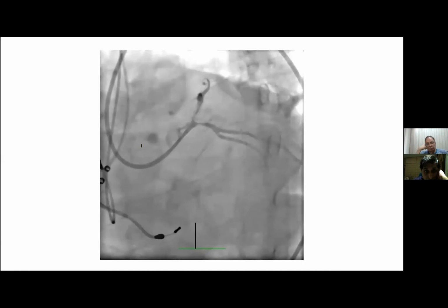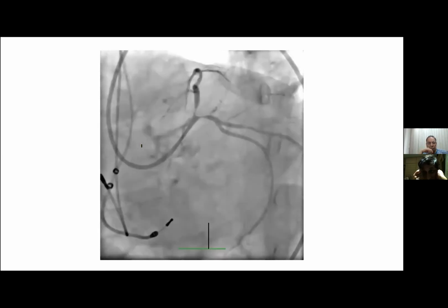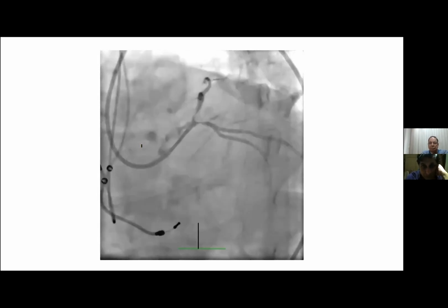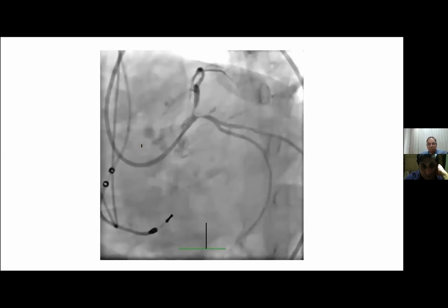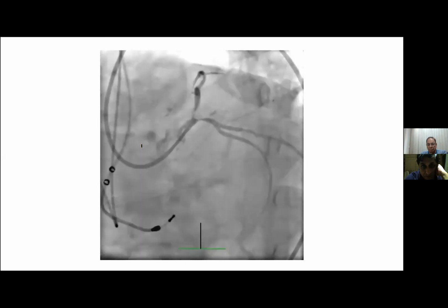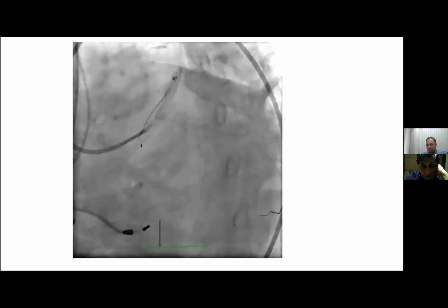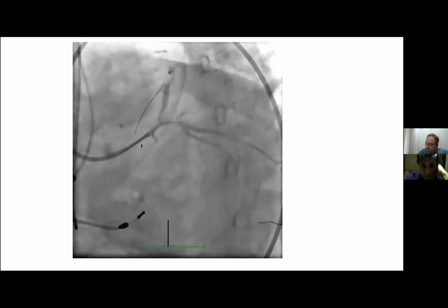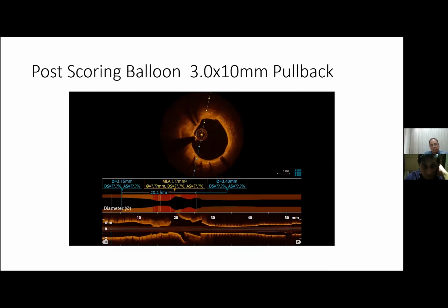So let's look at a left main bifurcation lesion. In this LAO-caudal view, angiographically, it's an ostial LAD and ostial circumflex. Left main looks pretty good and clean. Many people would think 011 is what it is. You can just do a good V stent, or just do an SKS and get away with a fast result. But let's look at the examination. We dilated both the circumflex ostium and the LAD ostium with a scoring balloon, and then did an OCT examination. This is a pullback.